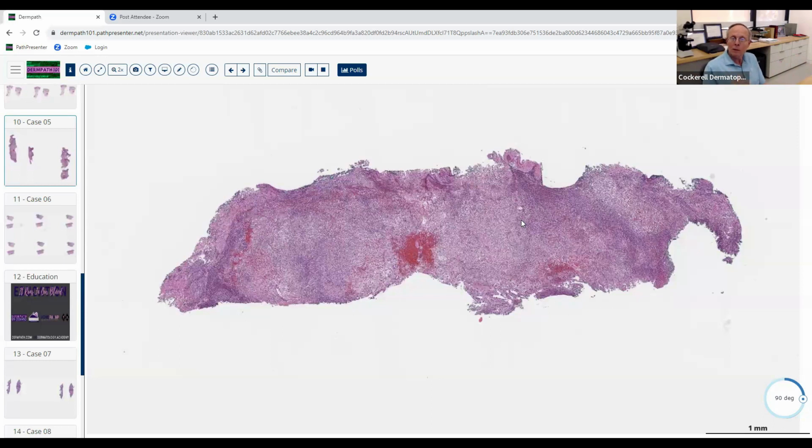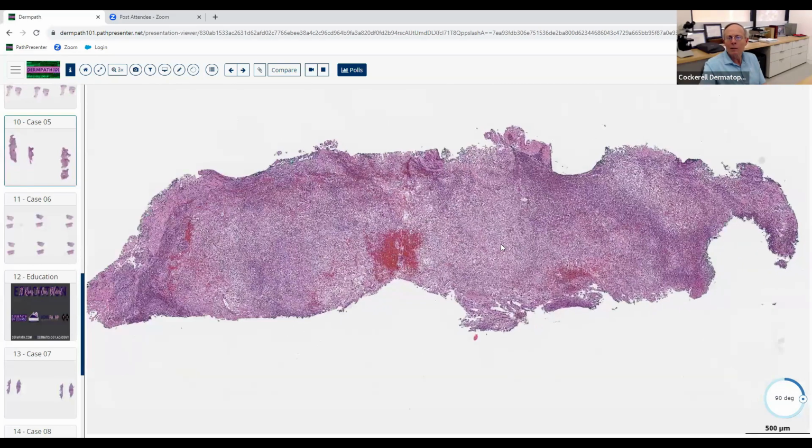Abscess. Cellulitis, though, interestingly enough, looks a little bit different. That's more of an interstitial pattern, mostly with neutrophils. That kind of looks almost like neutrophilic urticaria or some of the autoinflammatory diseases. But when you see tons of polys, those are really the few things that cause that. The dense neutrophilic infiltrates, you do think about things like that. Rheumatoid neutrophilic dermatosis can give you a dense neutrophilic infiltrate like this. So that's really what you would think about here.